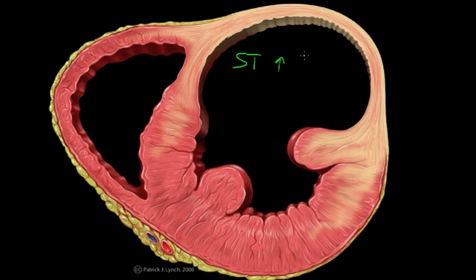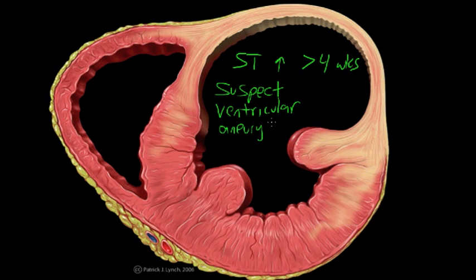Persistence of ST segment elevation beyond 4 weeks should raise suspicion for this cardiac abnormality. It's structural. Ventricular aneurysm. If ST segment elevation does not resolve within a few days of an MI, you should start thinking about ventricular aneurysm and get an echo to help make your diagnosis.